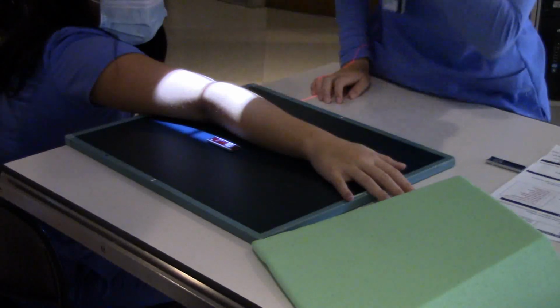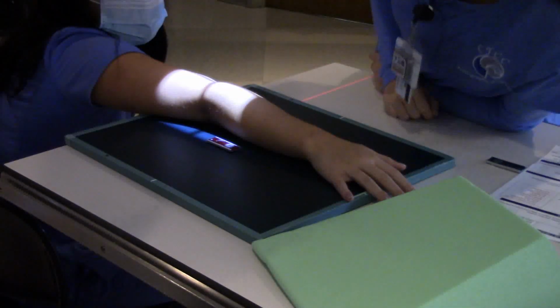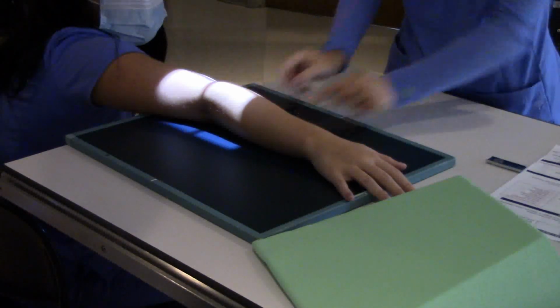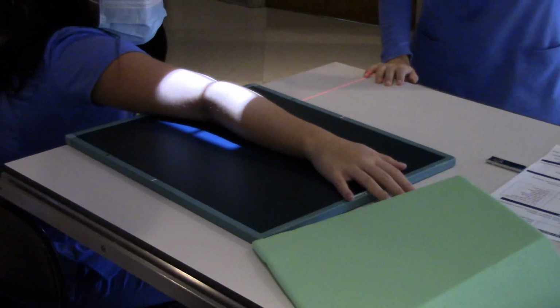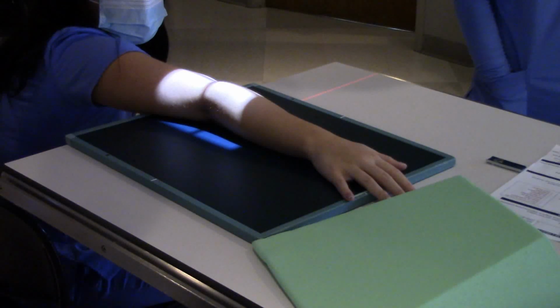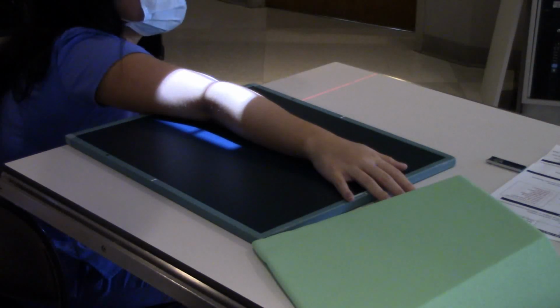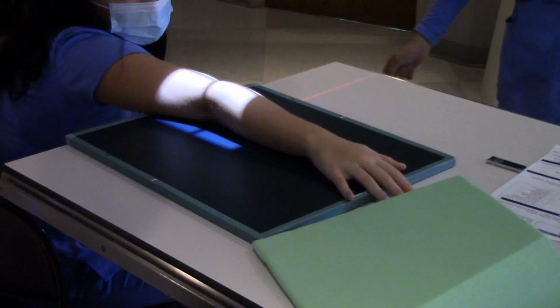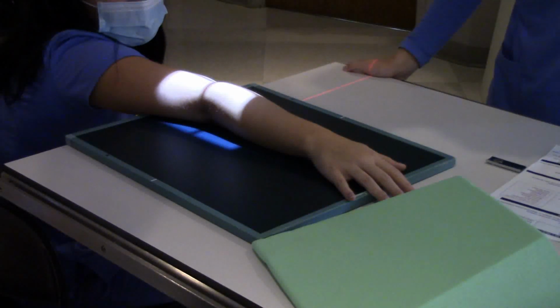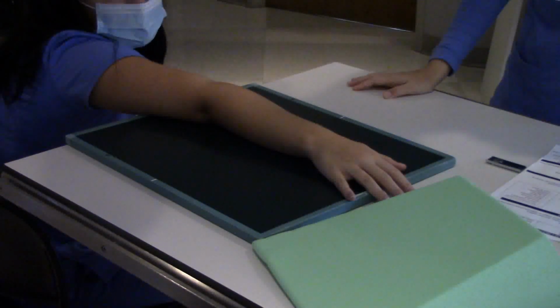Now, the main thing we're looking for on the internal oblique, and hardly ever do I see a doctor order this, once in a blue moon. What the doctor's looking for here is something in particular, it's some kind of process. The olecranon? Yeah. The coronoid process. The coronoid process of the ulna is what we're looking for, because sometimes that'll have a little fracture or an avulsion. It might even have a chip of bone knocked out of it. And this will let the doctor see if there's any problem there.